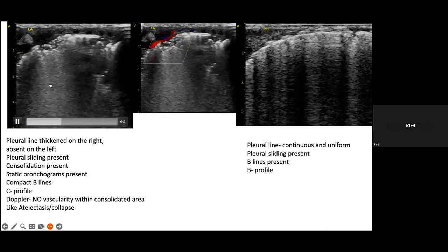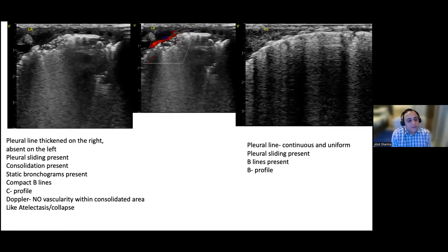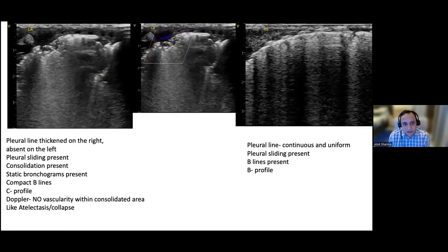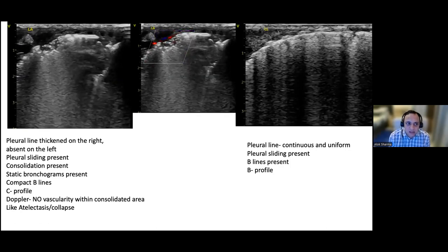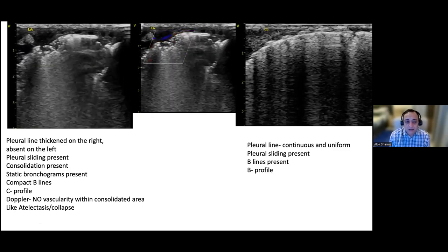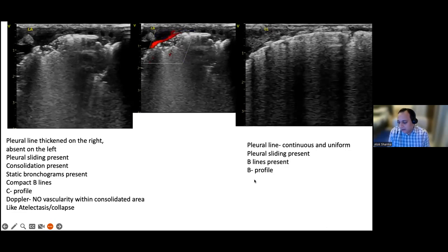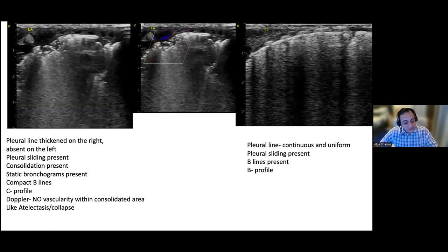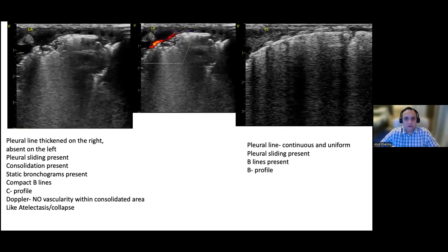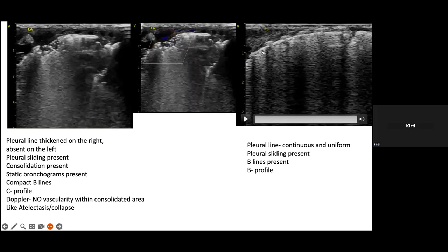Now, what is very important, folks, is I don't want you to get too fixated on the differentiation, because consolidation with atelectasis often coexist. Really, what you want to see, if you're thinking of pneumonic consolidation, is the presence of a fractal sign. And if you have dynamic air bronchograms, they go against atelectasis. They are two very sensitive signs. And then some babies don't read the book, as I'll show you today. But beautiful images.